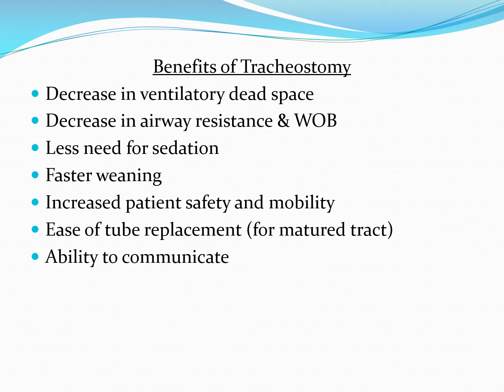Also, ease of tube replacement for a mature trach. Once the tracheostomy tube has been in place for a good month, that trach is nicely established. Maybe the tube's been changed once. From that point forward, future changes tend to be relatively straightforward. Also, ability to communicate. The less need for sedation that I just mentioned in the upper portion of this slide, and greater patient comfort, is about their ability to communicate, to eat, and things along those lines.